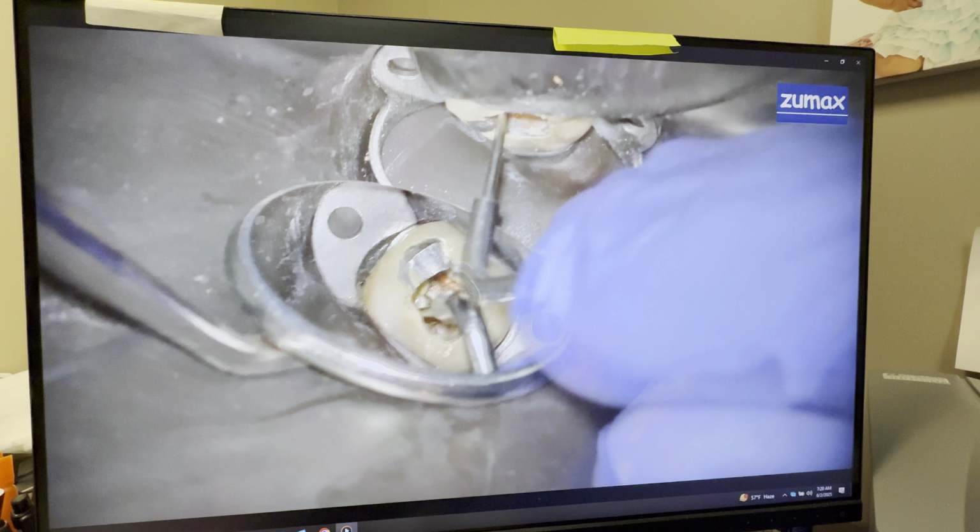But you can see the red staining of the dentin, pulp chamber floor, whatever this dentist used, because number 19 also had the same staining. All right, 6% hypo goes back in again, and you can see how good my assistant is, making sure that no hypo gets out of the tooth.